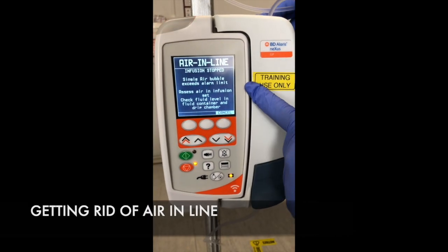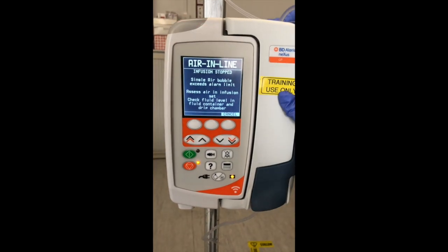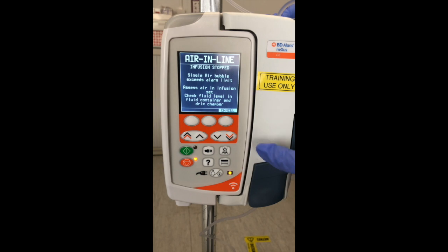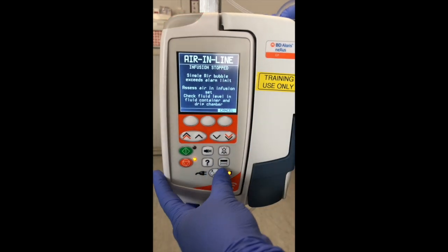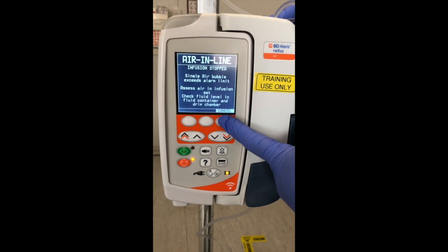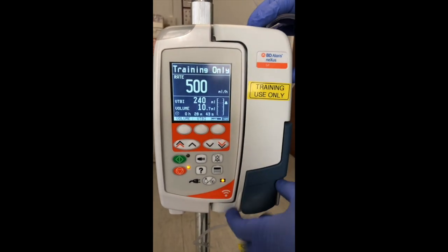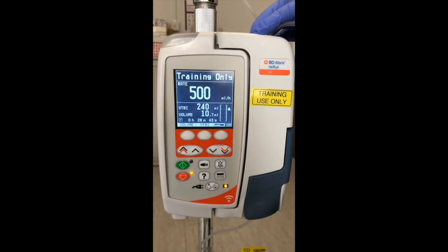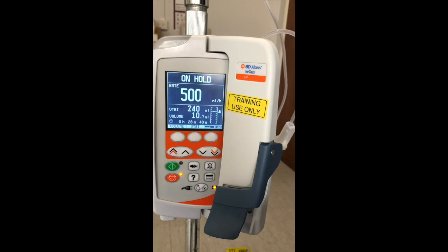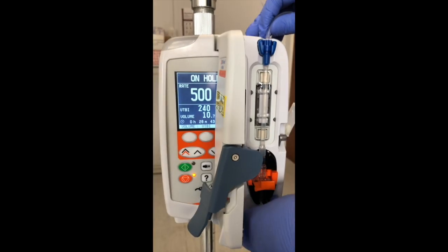When there's air in line in the pump, it will sound a red alarm that stops the pump. To get rid of the air in line, you're going to silence the alarm and cancel it. To get rid of the air that's accumulated in this part of the pump, you have to disconnect from your patient. Whilst disconnecting, ensure that you're maintaining good infection control measures. Take your line off.